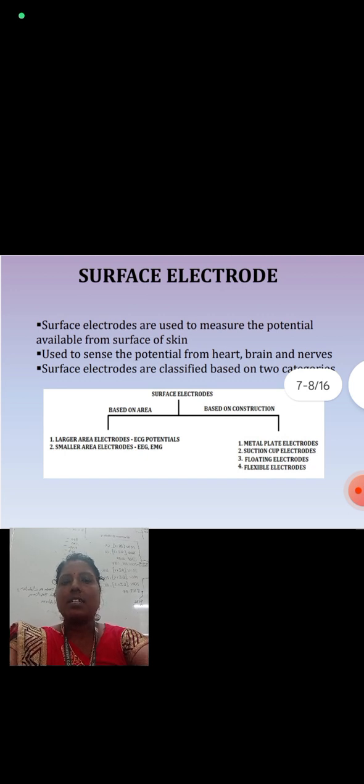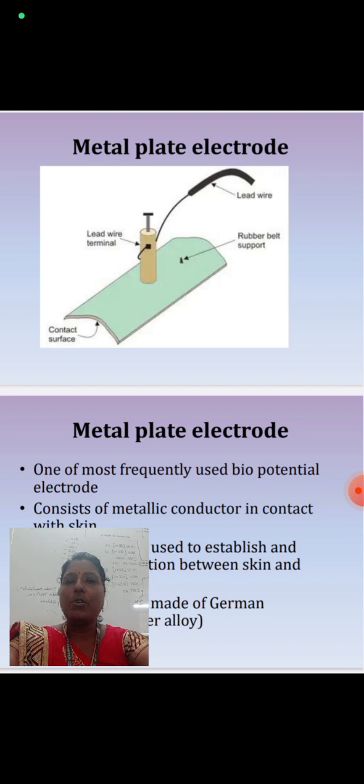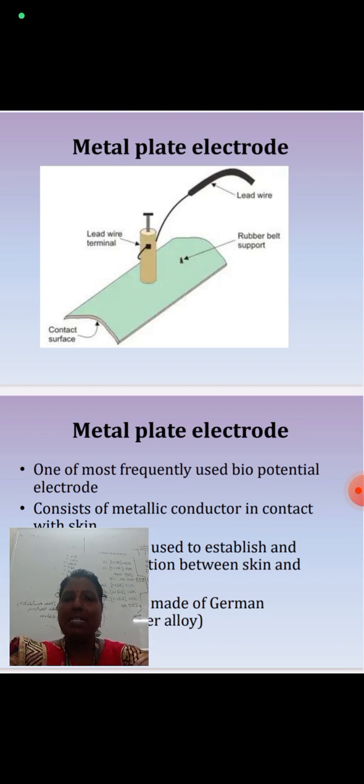First, let us discuss metal plate electrodes. The above diagram shows the metal plate electrode.